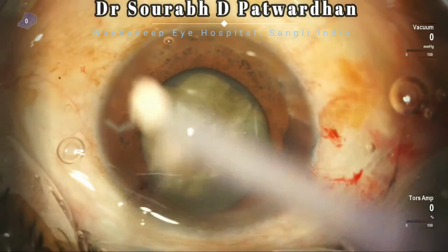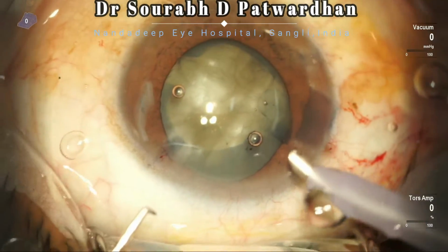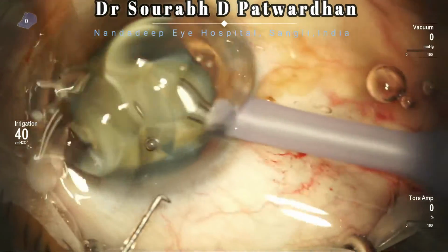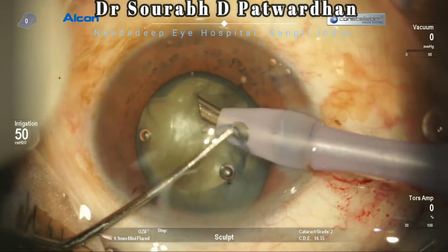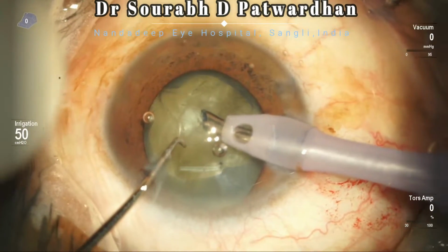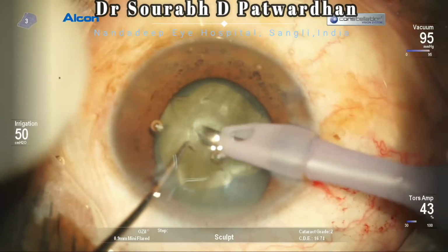Now, the main principle of doing Phaco in such a case is not to allow this anterior capsular rupture to go to the posterior capsule. The main movement which allows the anterior capsular rupture to go behind is the deepening of the anterior chamber. So the anterior chamber pressure should always be kept low.